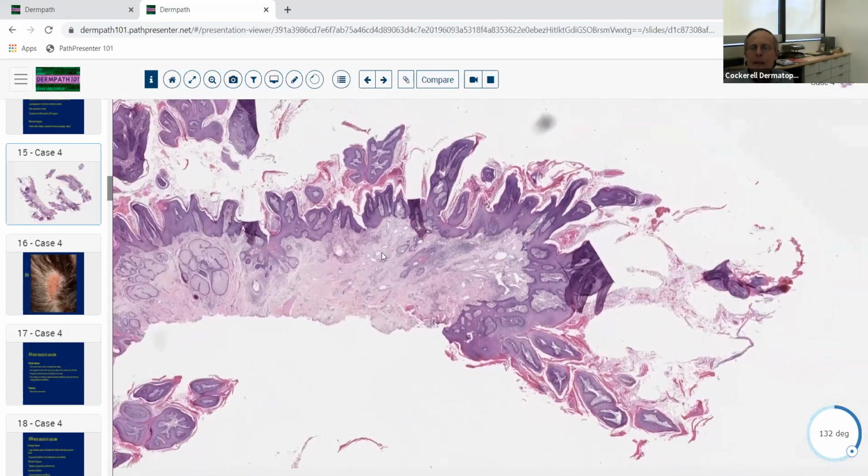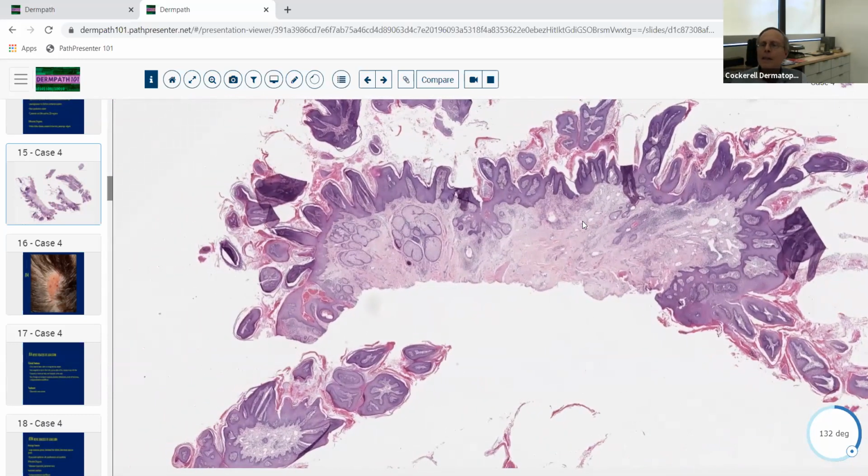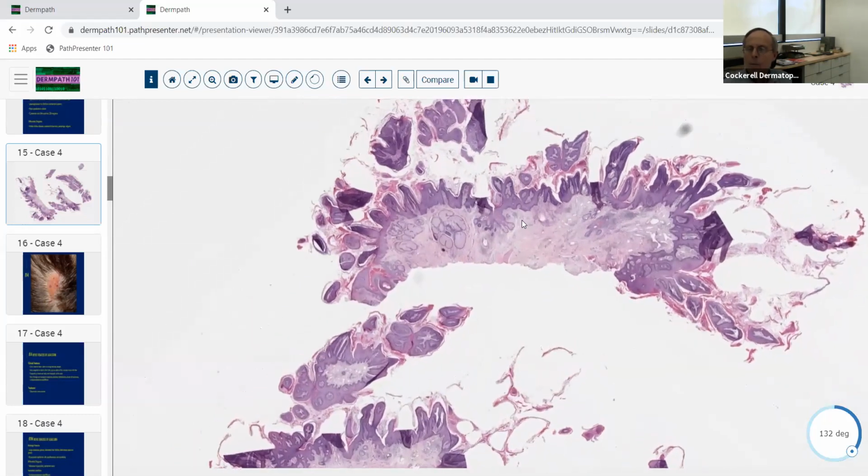Now, this is the kind of thing that they might show you, expecting you to get it pretty quickly, and then they might ask you about some of the clinical features of the nevus sebaceous syndrome that's been described. So we get CNS abnormalities and other things like that associated with this. They don't actually get basal cell carcinomas very frequently. That's also a very common follicular abnormality that we'll see associated with nevus sebaceous. They're really more trichoblastomas than true basal cells. Rarely they can get a real honest-to-goodness basal cell, but it's really, really rare.